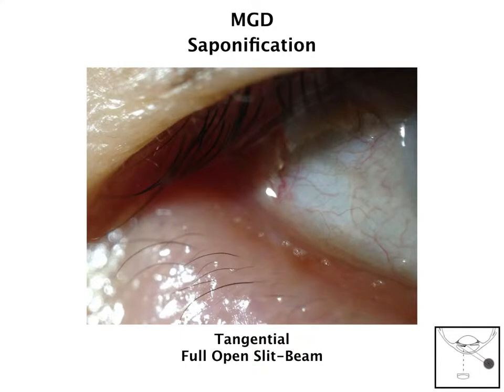Another time that you want to use tangential illumination is when you're looking at saponification. It kind of reminds me of when you're looking at a clear cell through a microscope — how do you contrast that? The best way is with a pseudo-indirect illumination with tangential illumination. You can really see that highlighted here on this photograph in this patient who had meibomian gland dystrophy, or MGD.